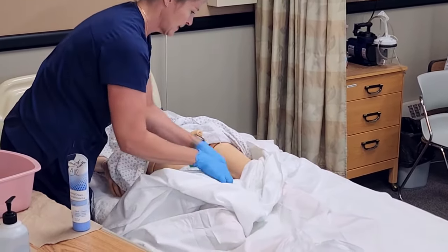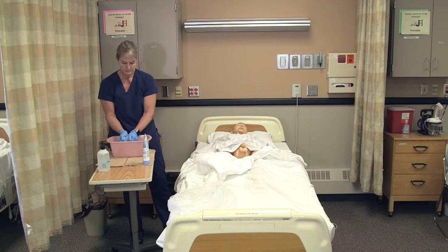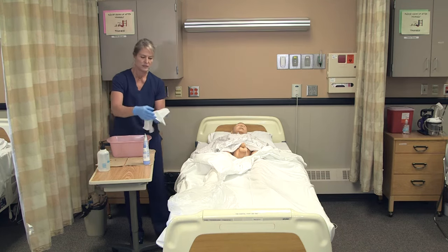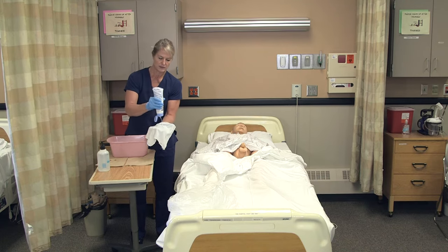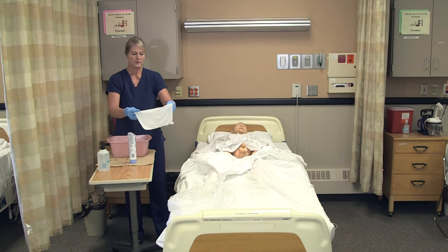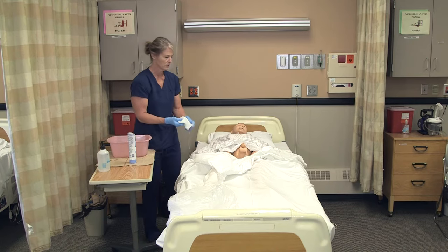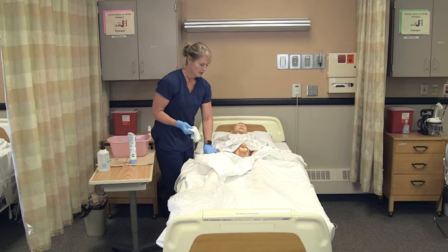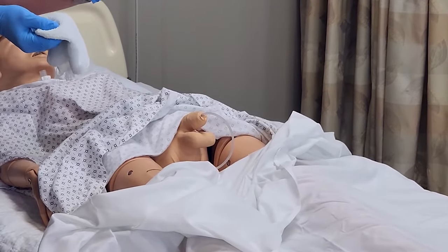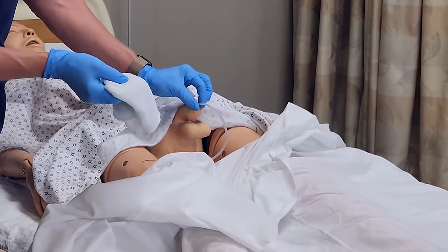Just like with peri care, we want to only use each area of the washcloth once. Once I put soap on, I'm going to fold that into four and then keep my thumb at that corner. It's important for you to stand on the side of the bed with your dominant hand so you can hold the catheter with your non-dominant hand and clean with your strong hand.